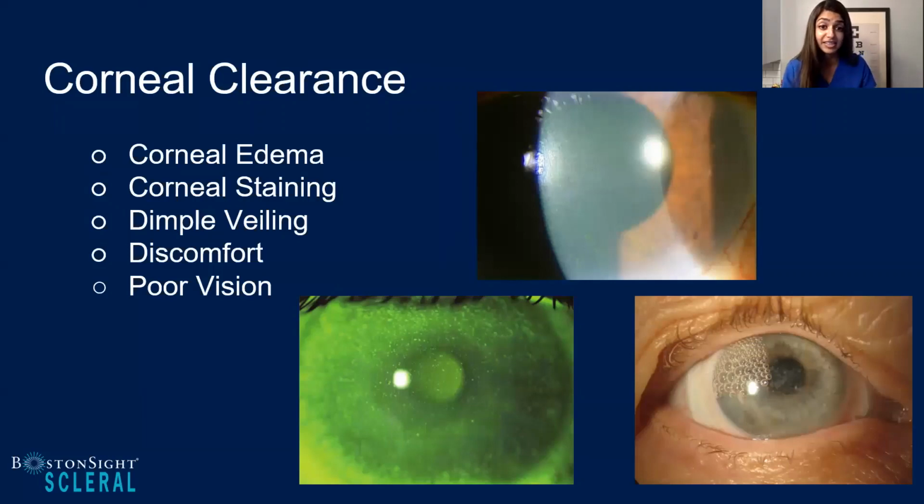But the goal for us as practitioners is not only to be fitting the lenses, but also to be looking at the eye that you're managing and treating. So corneal edema is one of those complications. Personally, for me, I like to take baseline pachymetry readings, and then also during my fitting, as well as every follow-up, I'll take that lens off and get a pachymetry value. I find this especially crucial for corneas that are going to be more susceptible, for example, our corneal transplants.